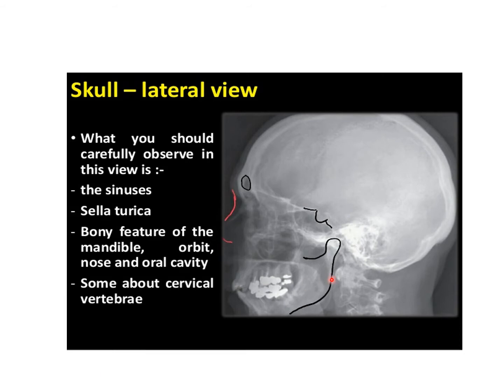Now the next is the skull lateral view. Here you should observe for the paranasal sinuses — all the paranasal sinuses are visible in the skull lateral view. Also you can see the sella turcica and the bony features of orbit, the mandible, nose, the oral cavity, and also the cervical vertebra.